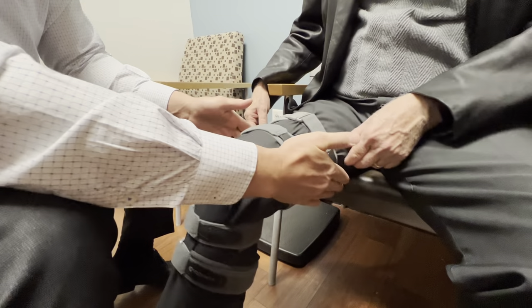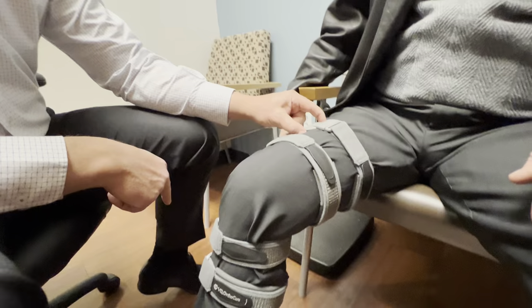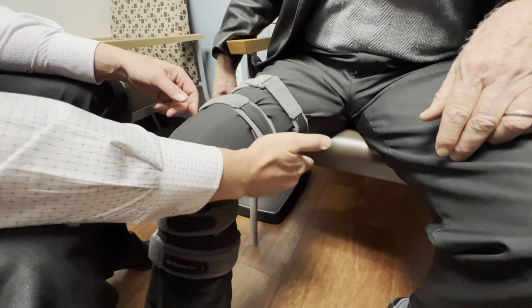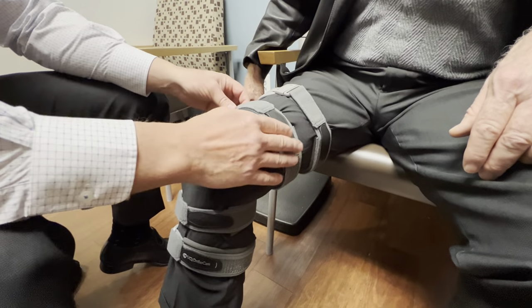These always do come back a little bit — the ones on the thigh — it's because of where this is. If you have a big patient with a real big thigh you might actually make the strap even longer so that it doesn't interrupt, but he's a nice big guy so he'll be fine.